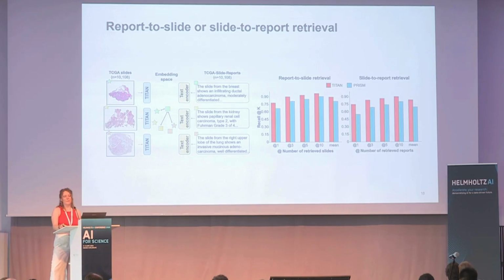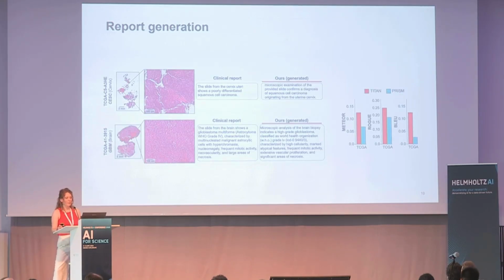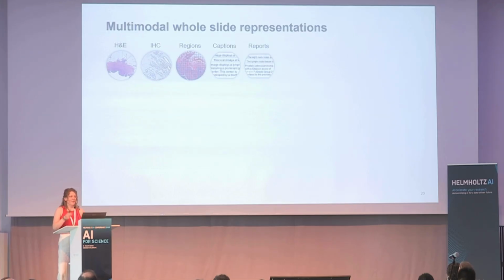And finally, the model can also generate reports, which we didn't evaluate clinically, but we evaluated it on measuring the semantics. And the next step would then obviously be to test this in a clinic, whether the descriptions contain everything we want to see. And this brings me already to the end.